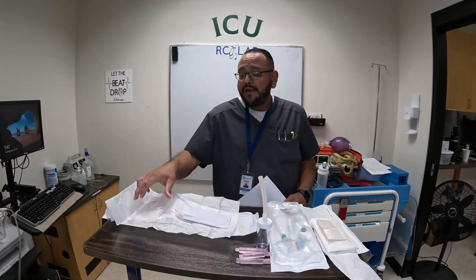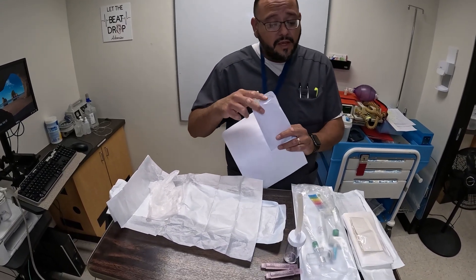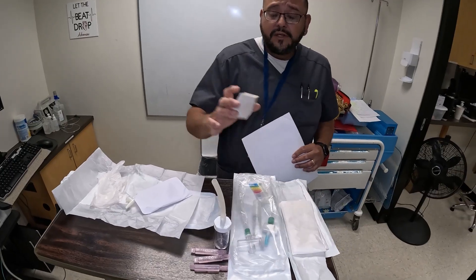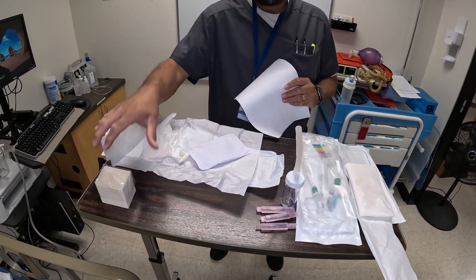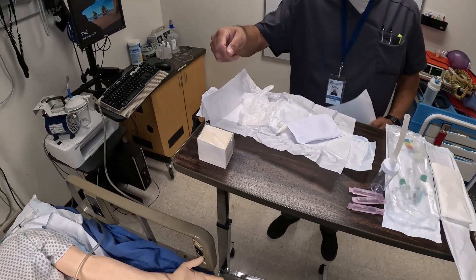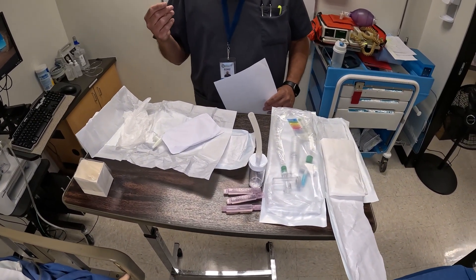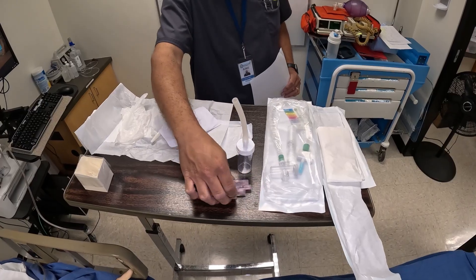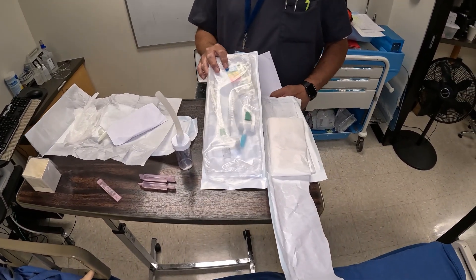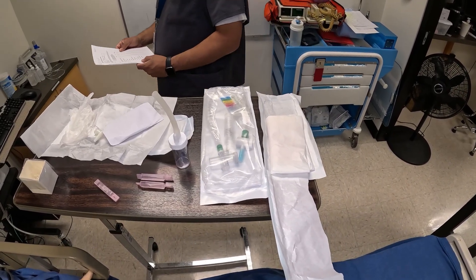We should have sterile gloves, a suction catheter — there are different sizes; this one happens to be a 14 French catheter — and you should have a basin. The basin just unfolds and you push the bottom to set it up, and now you have a basin where you can clean your suction catheter and put saline in. You would also have some water-based lubricant. I have a trap in case we need to get a sample when we suction, saline bullets, and an ET tube suction Ballard which we'll go over when I'm ready to demonstrate.